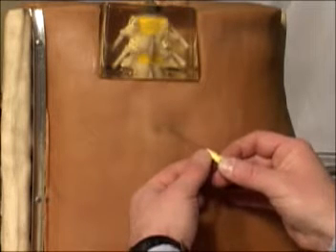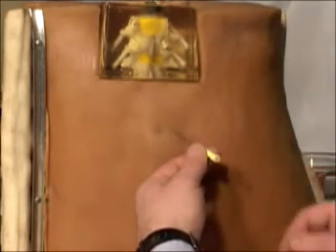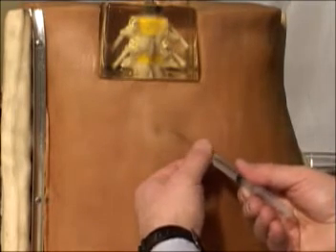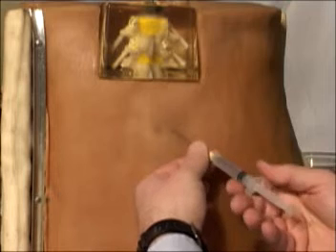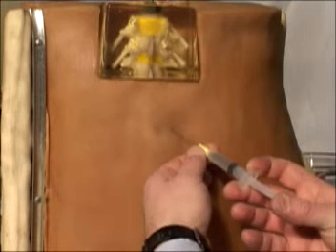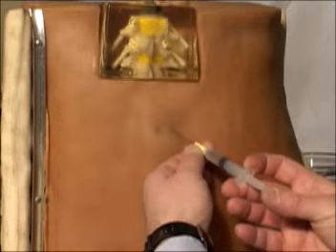For more detailed directions, please refer to the full article on the website shown at the end. Shortly after introduction, we encounter resistance at the yellow ligament. We then remove the stylus and attach a syringe body filled with sterile normal saline, applying gentle pressure to the syringe plunger as we penetrate the yellow ligament. When the resistance to the saline injection drops sharply, we have penetrated the yellow ligament and the needle is now in the epidural space.